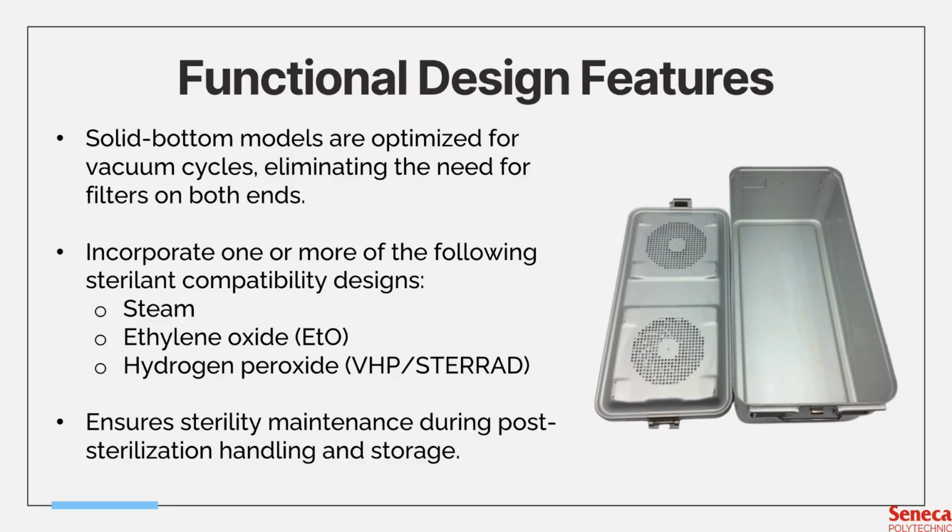Now, functional design features. Solid bottom containers are optimized for vacuum or pre-vacuum steam cycles. What you see here is a solid bottom container. There are some containers that also have perforation on the bottom, and typically those are saved for the bigger containers, ones that require added sterilant penetration and air evacuation.